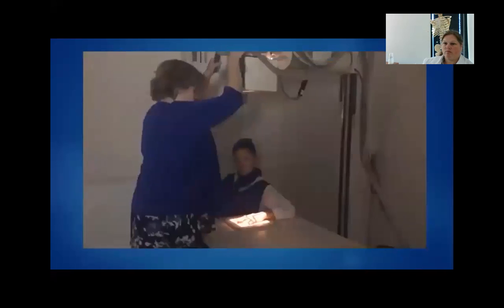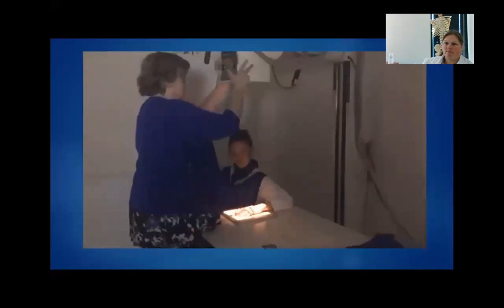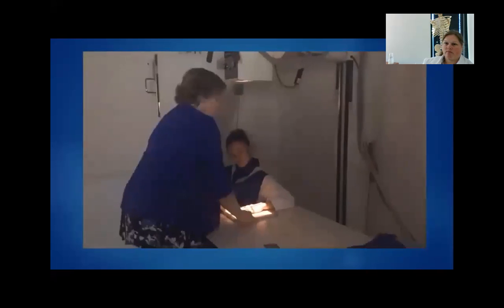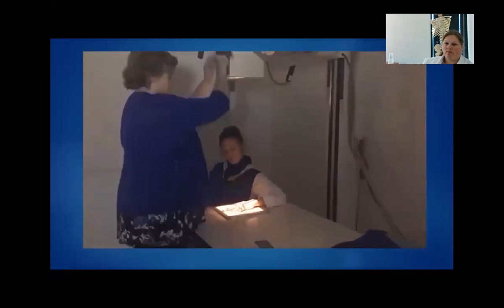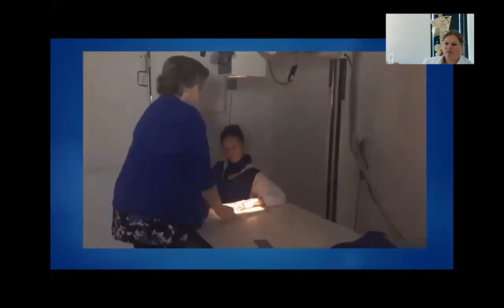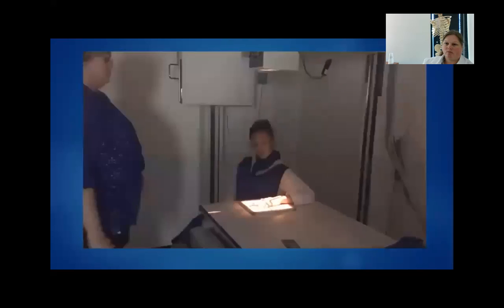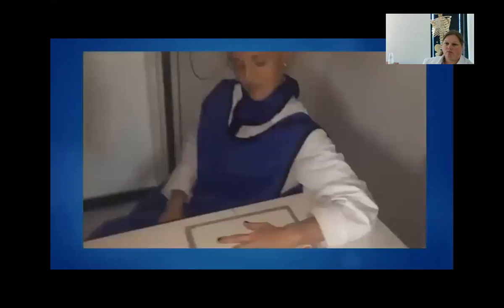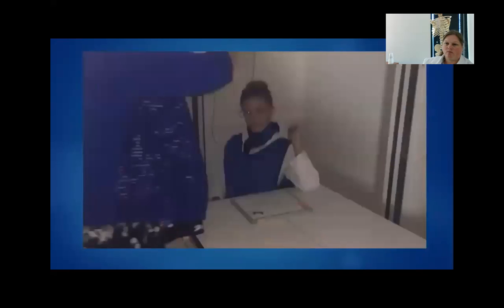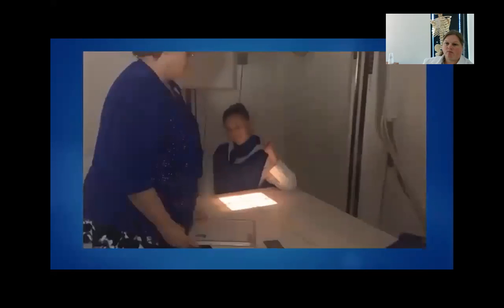Not playing too well. All right, so hand palm down, all on the same plane. Center to the third MCP. And collimate down past the carpals. And change out your IR.